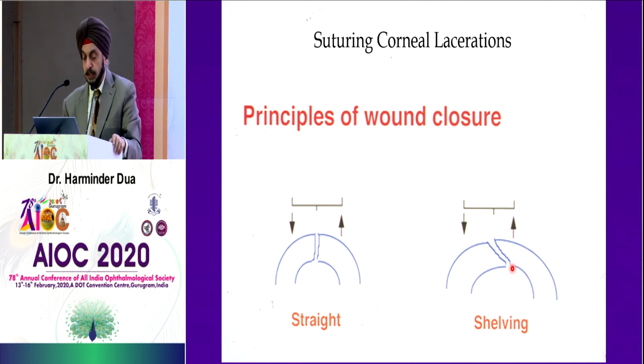So what you would do is, it's very important that the distance from the edge on the underriding part of the wound is further away than on the overriding, so you get the right compression to bring it together. If you look at the forces that are applied, it is also written, and probably rightly so, that if you take the internal edge, the internal part of the wound as a center, you could then probably place your sutures around that point rather than around this point, and you can get equal compression. But this is what I follow: go further away from the underriding edge and closer to the overriding edge.